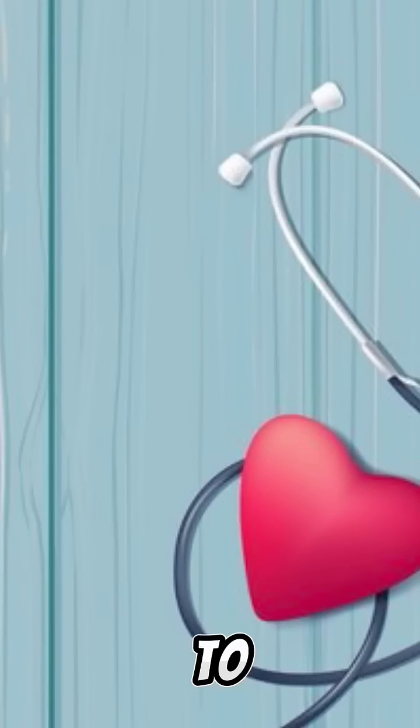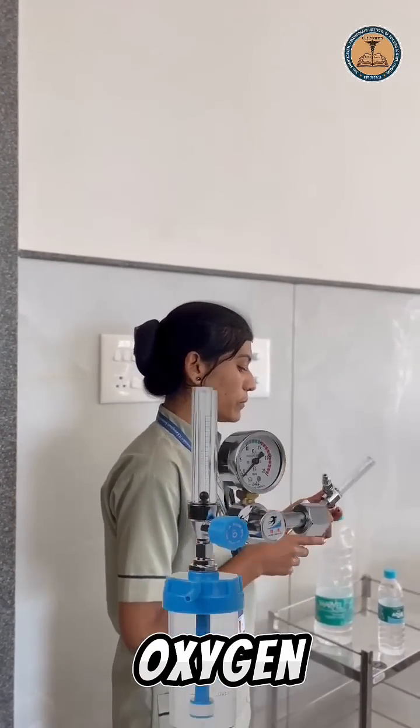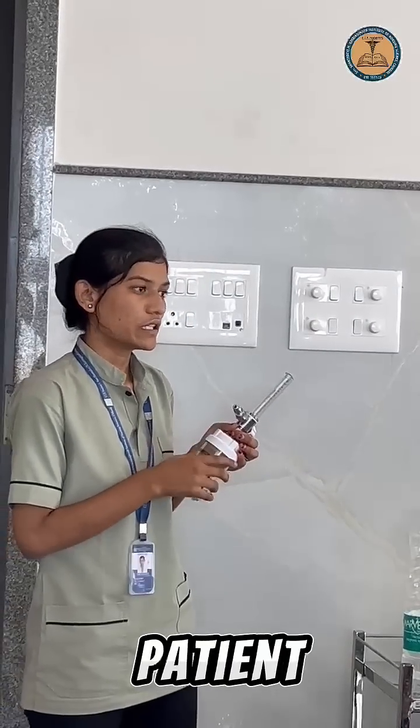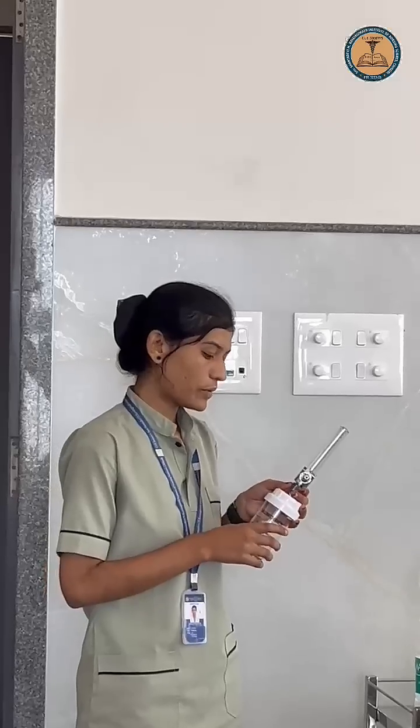Today, I am going to give a presentation on a very important medical device, the oxygen flow meter. Let's begin. Oxygen flow meter is a medical device used to regulate and measure the flow rate of oxygen being delivered to a patient. It ensures the patient receives the correct amount of oxygen as prescribed by the doctor.